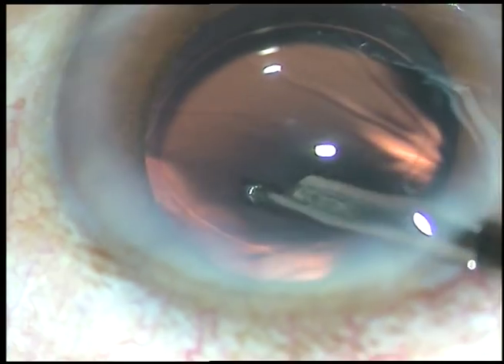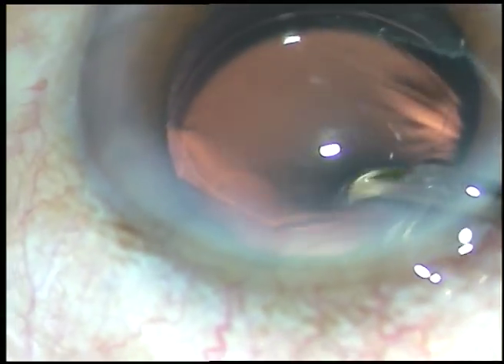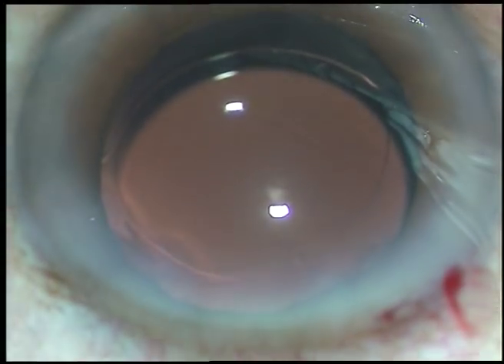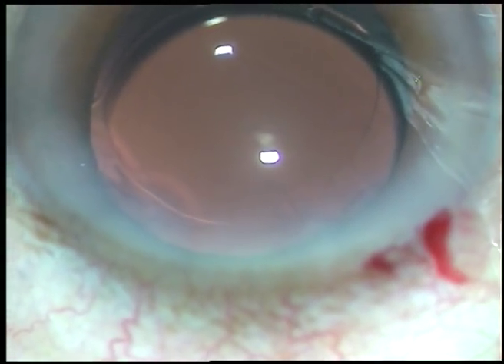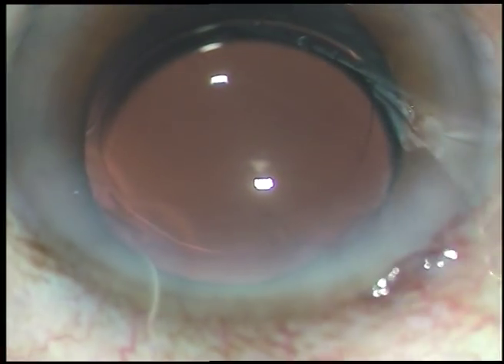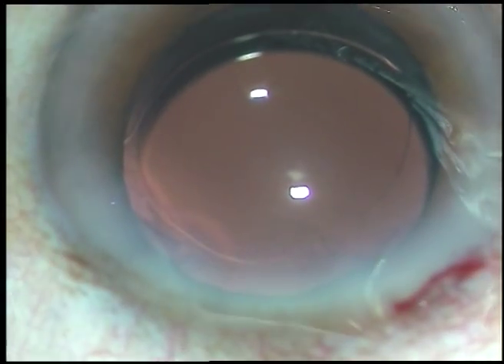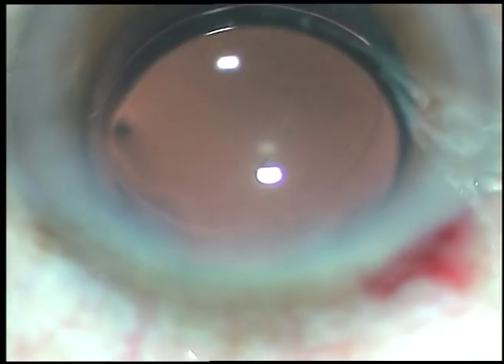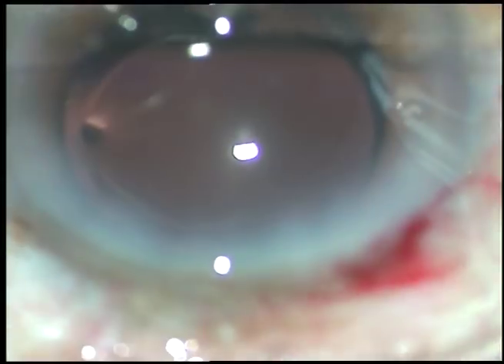Give a final lavage of the anterior chamber, form the anterior chamber, and never forget to check the integrity of the wounds — there should not be any leakage from any side. Thank you very much for watching. Hope this video will help you in developing your surgical skills. I'm in Copenhagen now, but I want you to be a better surgeon.